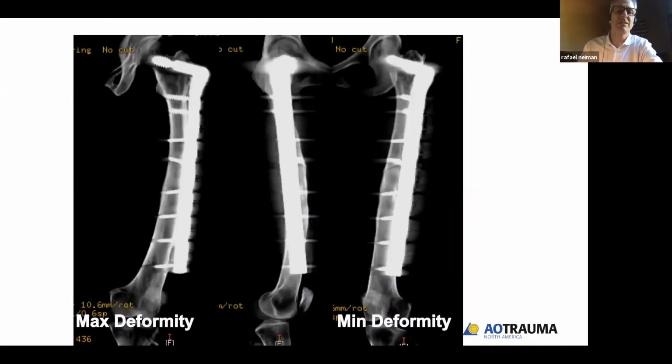I know we don't always get CTs on every long bone deformity, but I felt in this case that I wanted to study that fracture a little bit better, and I wanted to see what the rest of the bone health looked like for when I was going to cut into it. Of course, you've got this giant plate. The reason I brought it up was that it doesn't really help me for looking at the frontal and sagittal necessarily.